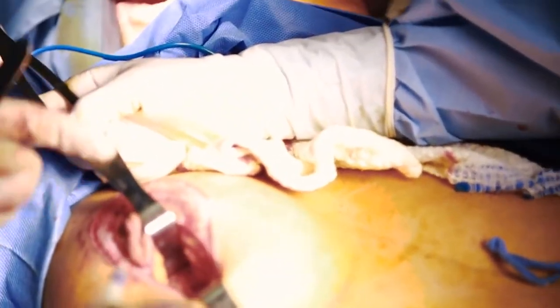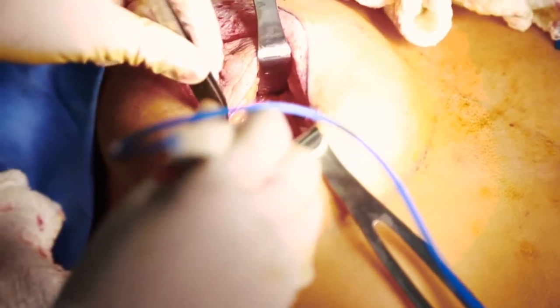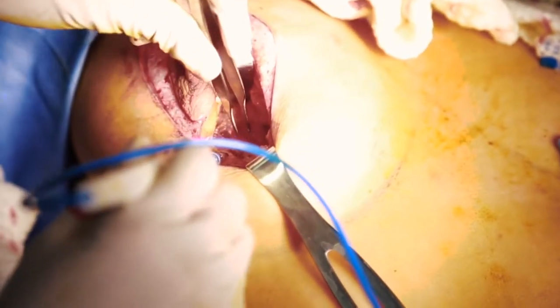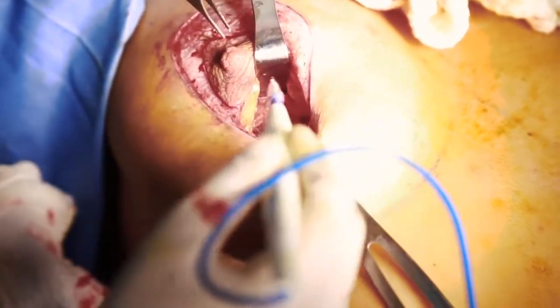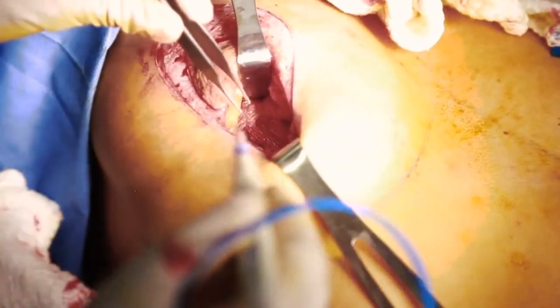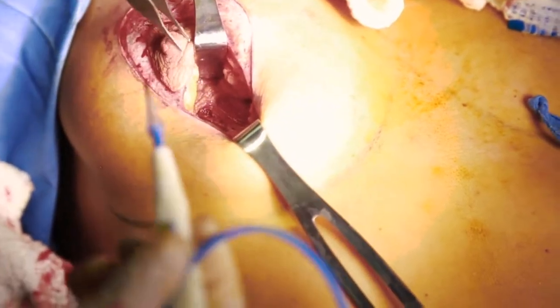What we have done here is start the dissection on the right breast. We have identified the pectoralis muscle. We are going to dissect the pocket under this muscle to create extra coverage for the breast in the upper pole, and in the lower pole it will be covered by the normal breast tissue.